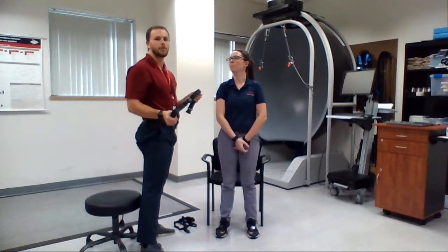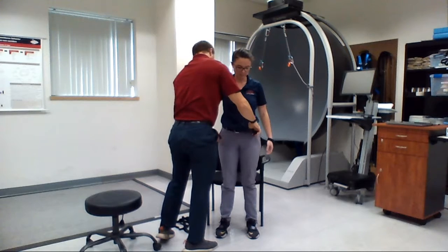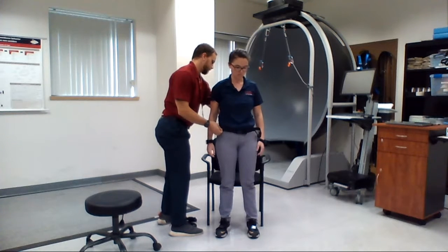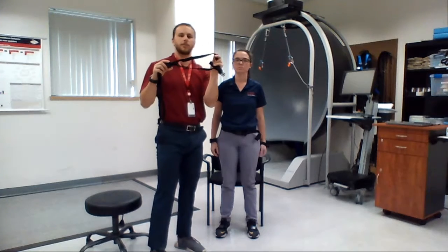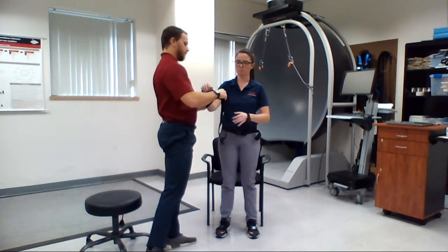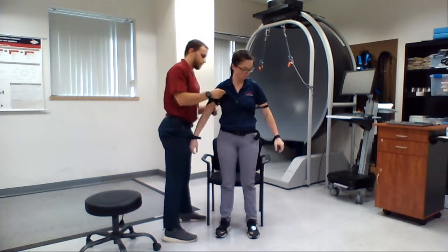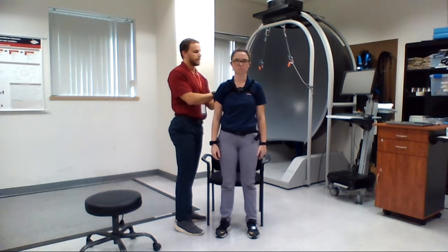The lumbar sensor will go just below L5. Finally, the sternum sensor goes with each loop inside the patient's arms and connects in the back. Once all the straps are in place and tightened, you're ready to begin testing.